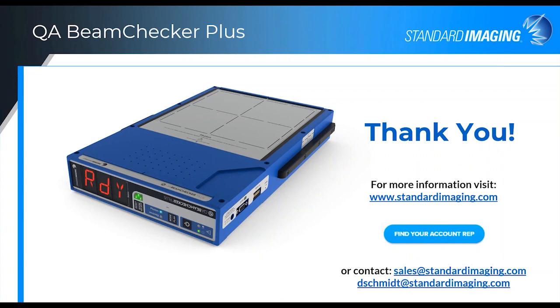Another question about what is the automatic energy detection, what is the method used and the accuracy achieved? So I can tell you that the method is essentially we have filtered ionization chambers there. So those 3 channels that I discussed, the central channel is always used in the scheme, which is an unfiltered beam.